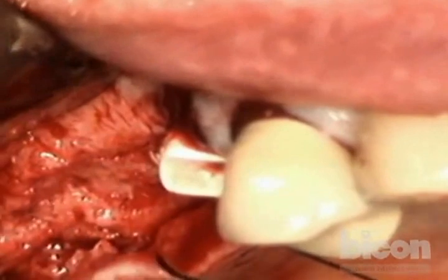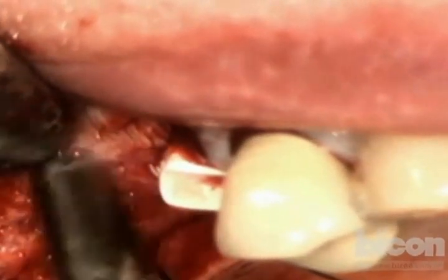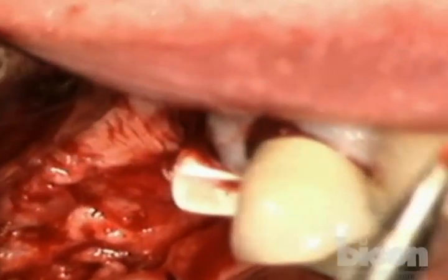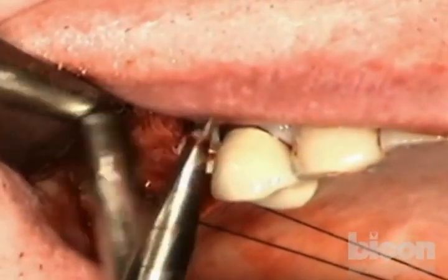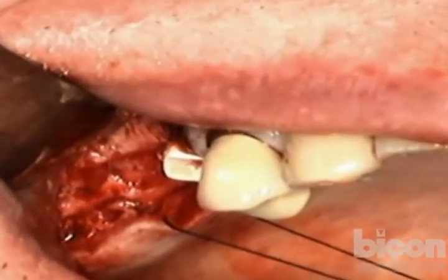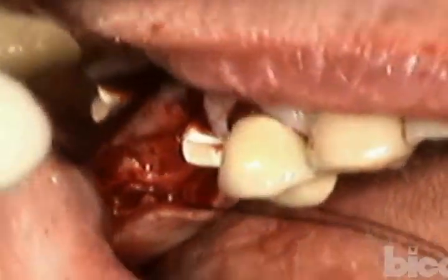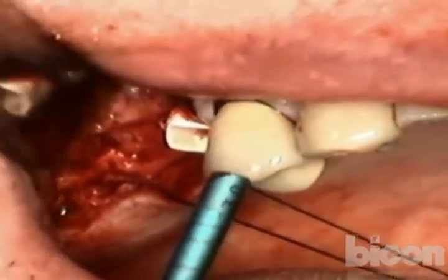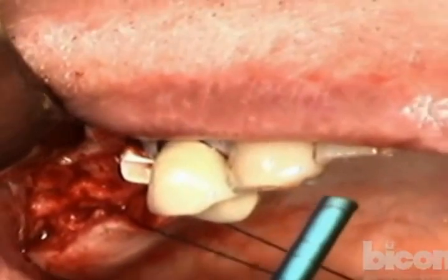Yes? Doctor Hart, what are you using right before? Oh, all right. I'll show you in a minute. For the scoring, I'm using ridge split osteotomes. This is a 5 millimeter one. And the other is the sinus floor flat osteotome. This is a 3 millimeter one. We have 2.5, 3.5, 4, 5, and 6 sizes.